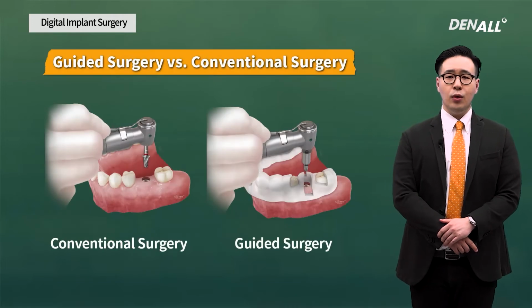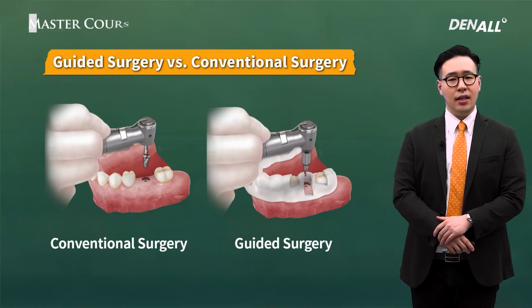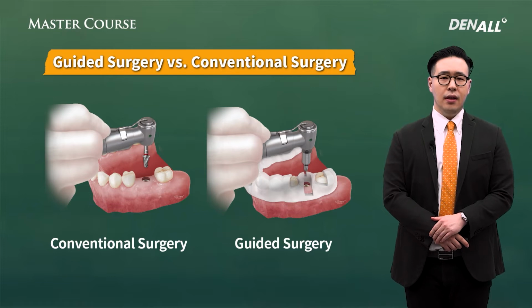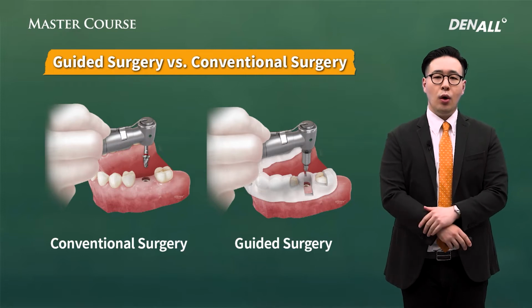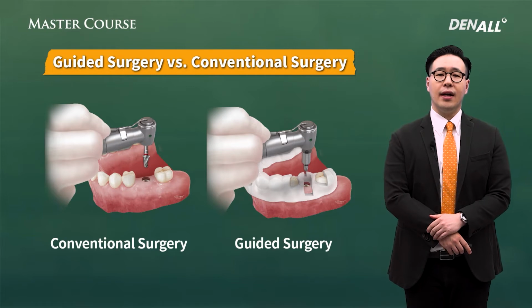If you use the guided template as on the right, you need to have the appropriate drilling kit for the guide. This special drill barrel comes in contact with the guided template as it enters into bone or expands the drill hole in the planned position without errors.